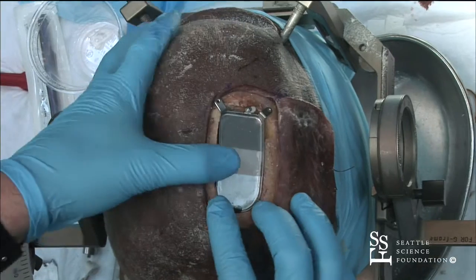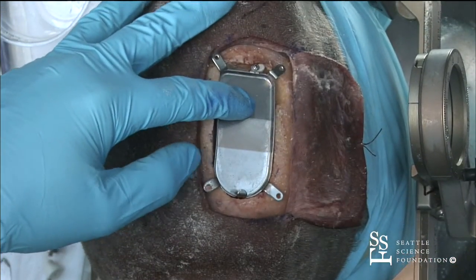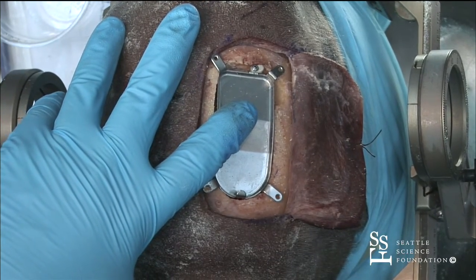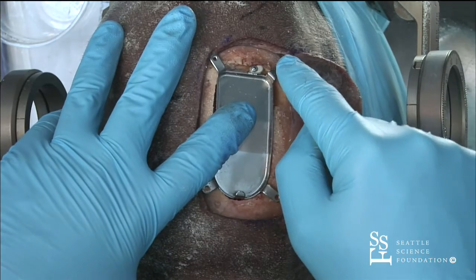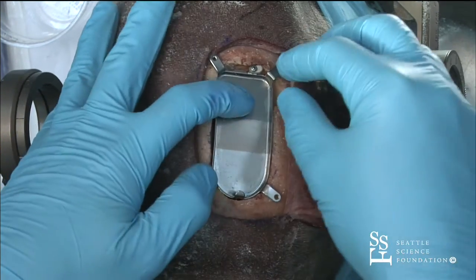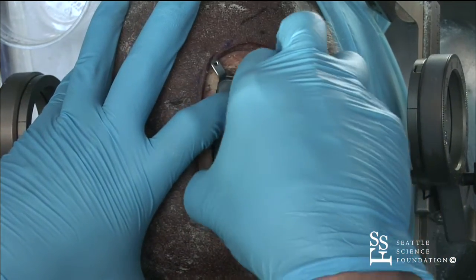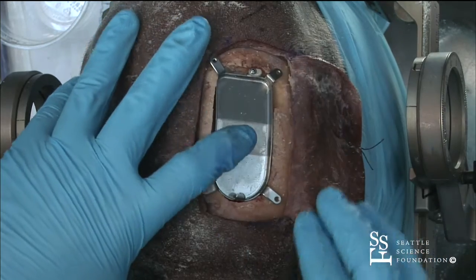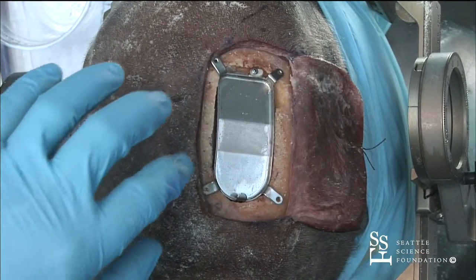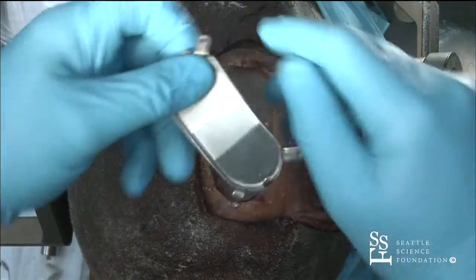So let's see, you can also see that with 4 tabs, unless you have a perfect sphere that you're putting it into, there's a good chance that one tab or the other will be elevated over the skull. And so you may have to overbend one tab or the other to get it flush onto the skull. And so the goal in the end is to get it deep enough such that once the battery is in, it's flush with the skull.